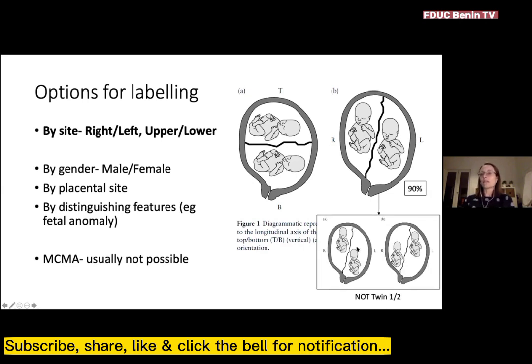As you can see in this graphic here, the twin on the left, who is actually presenting, so is closer to the cervix, if that twin just moves superiorly within its sac, then it's no longer the presenting twin, and actually at subsequent scans it might look like this twin on the right is the presenting twin. And that's really important to continue to label each twin appropriately at each scan, because if we're monitoring fetal growth, we need to be comparing the same twin each time.